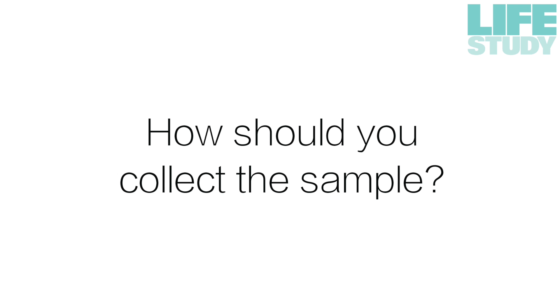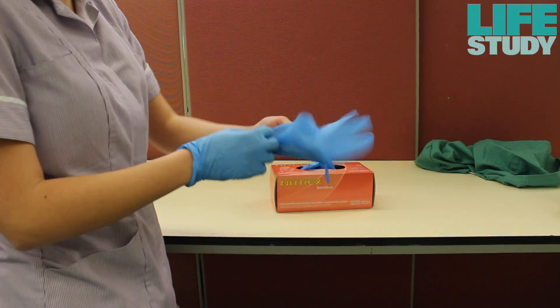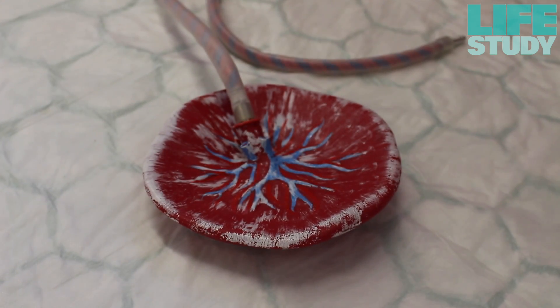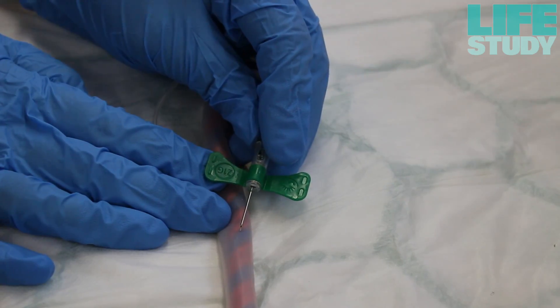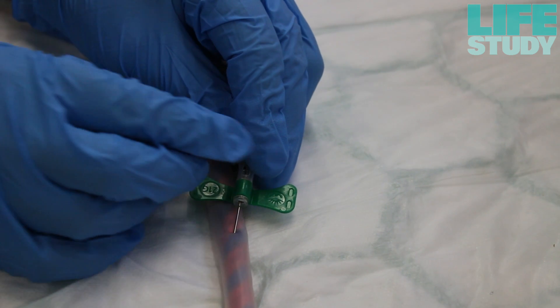Samples should be collected by a midwife. Put on the non-sterile gloves. Place the placenta and the cord onto an Inco sheet in the delivery room. Insert the butterfly needle into the vein or artery of the umbilical cord.